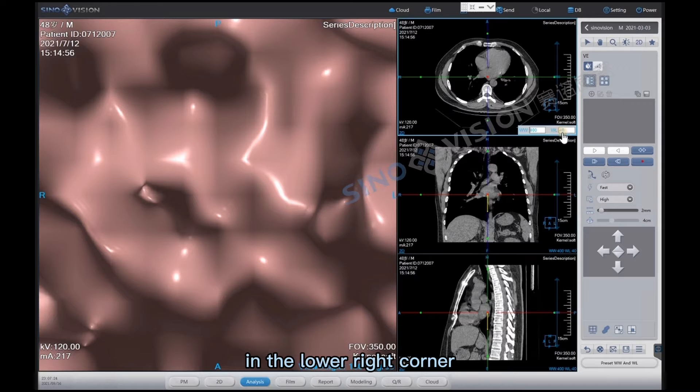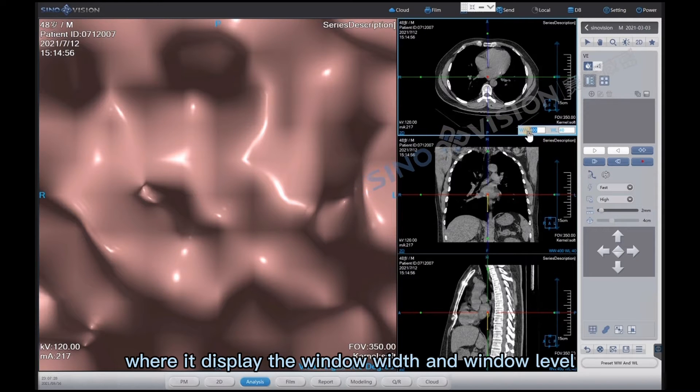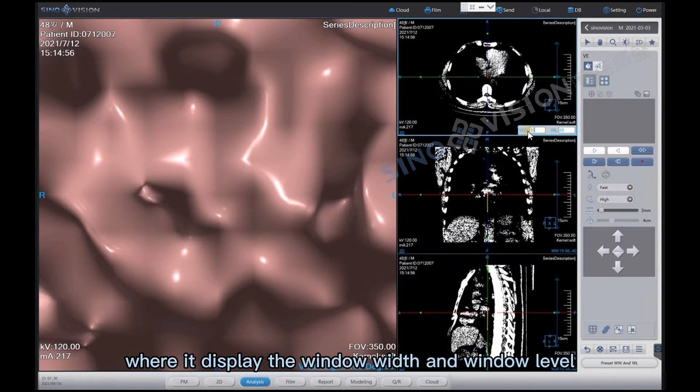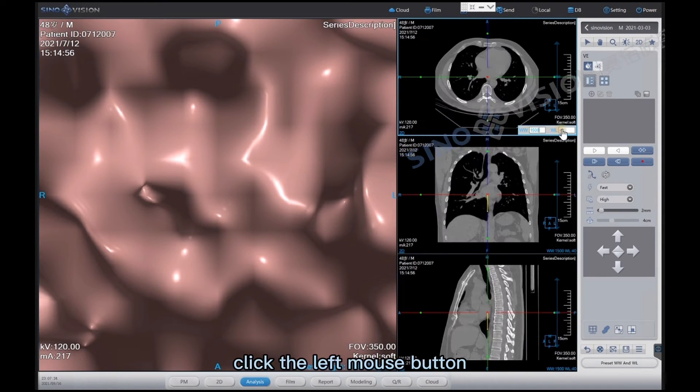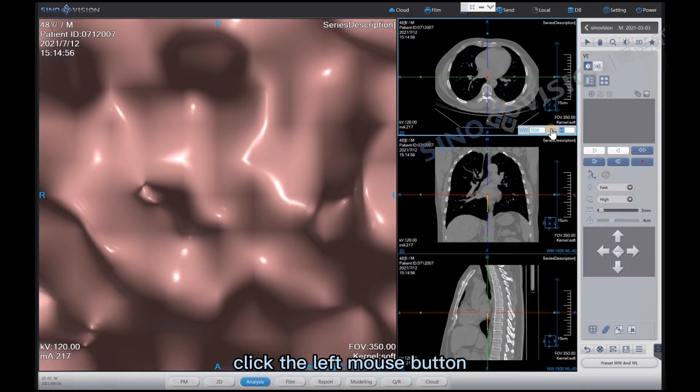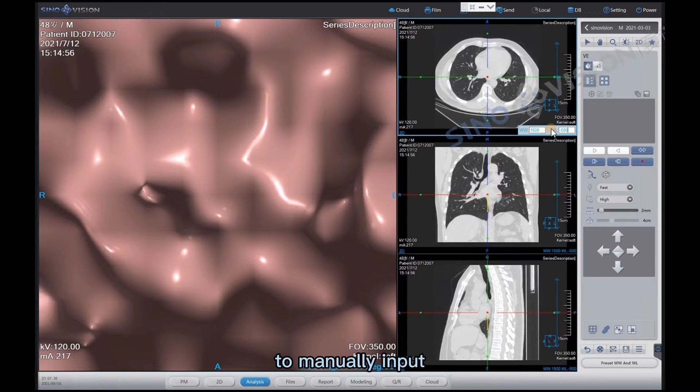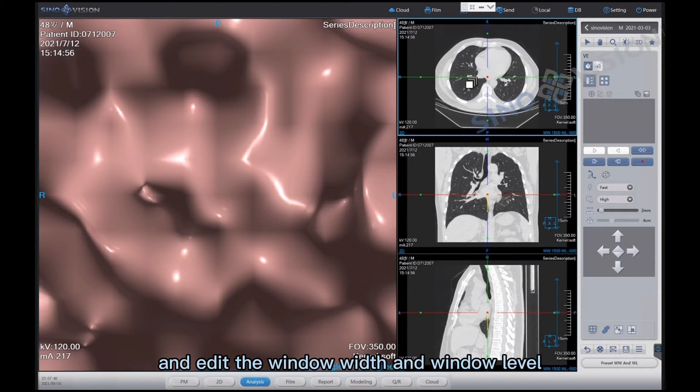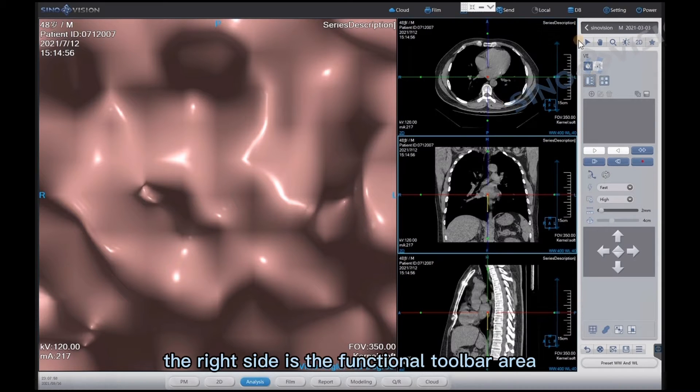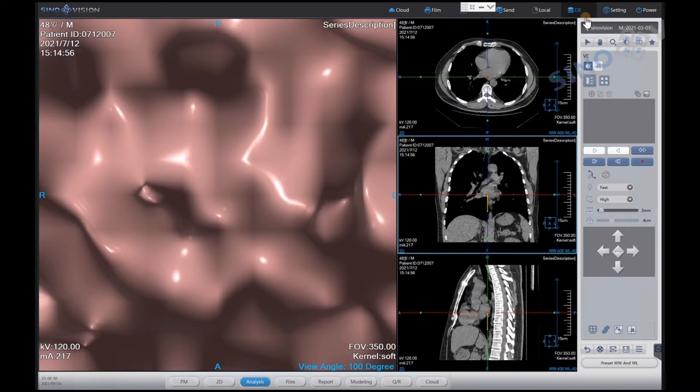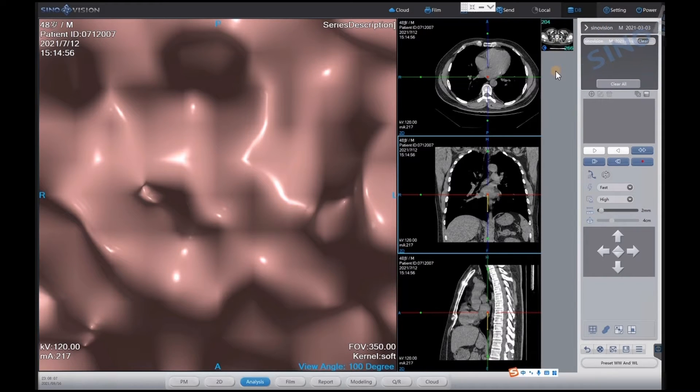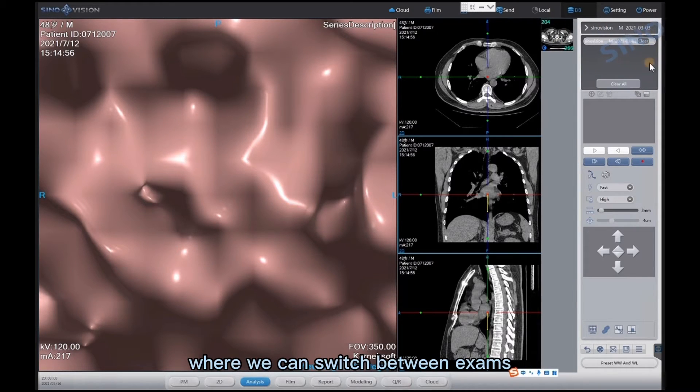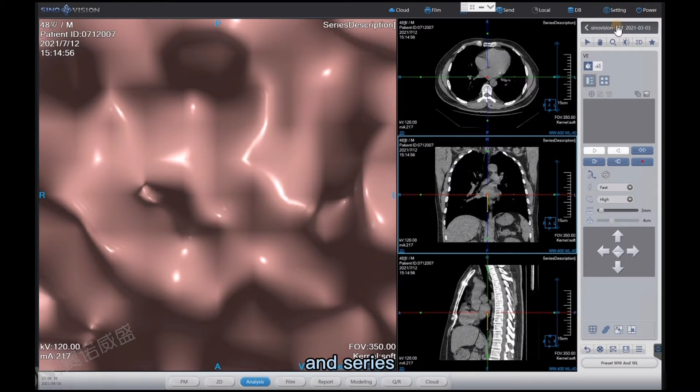In the lower right corner it displays the window width and window level. Click the left mouse button to manually input and edit the window width and window level. The right side is the functional toolbar area. Patient information is displayed at the top where we can switch between exams and series.